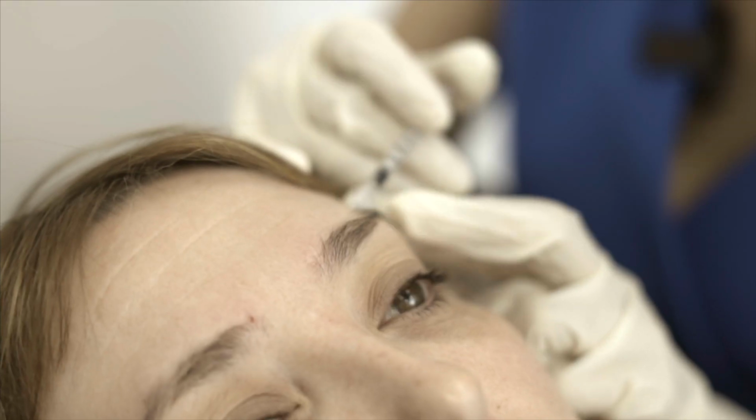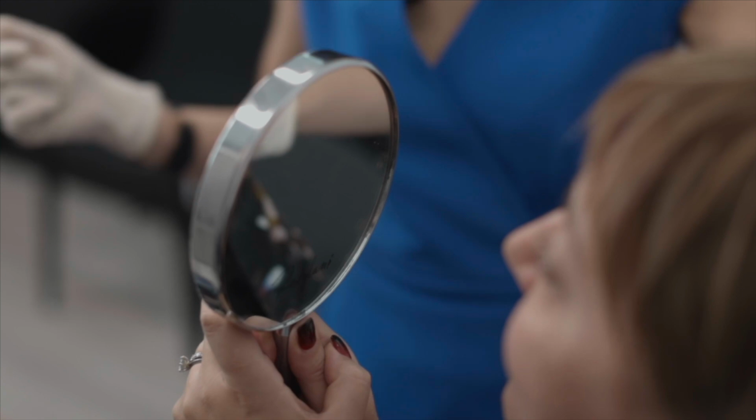Julie's got beautiful skin, so hardly any lines anywhere. But we've talked about treating this part of the mouth a little bit just to support and give the area a little bit of structure. So we'll be doing that with a little bit of the soft dermal filler today. So both superficially in the line itself and a little bit in this area here where we naturally lose volume as time goes by.